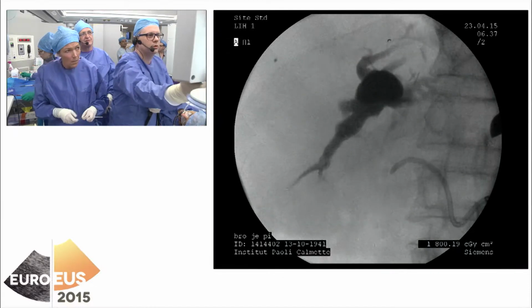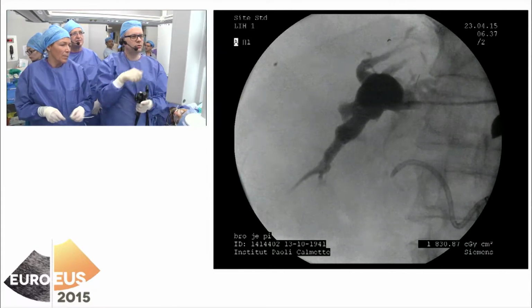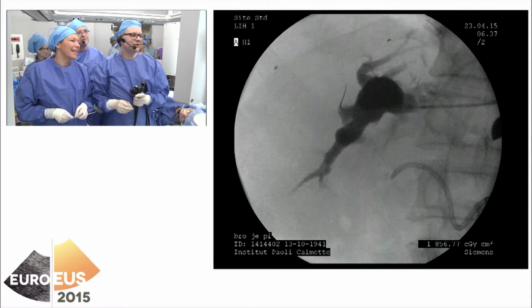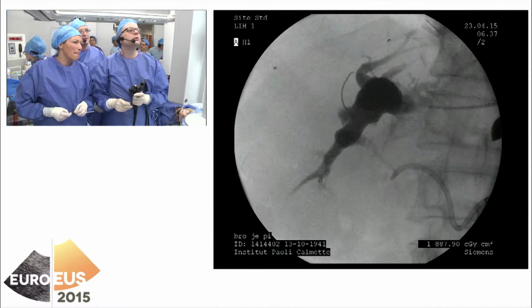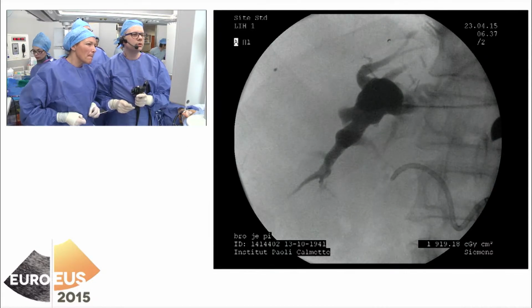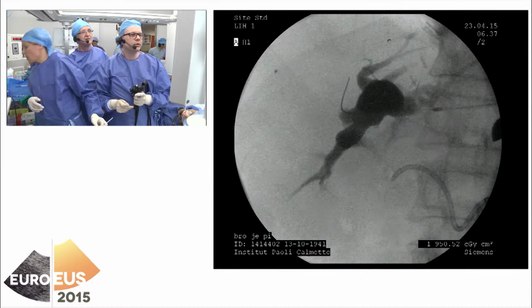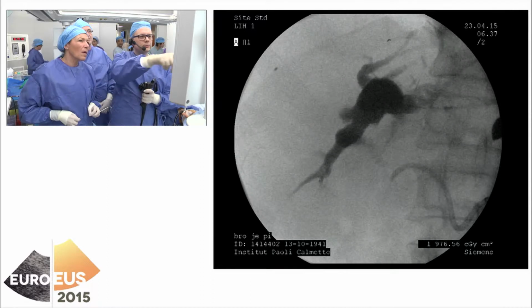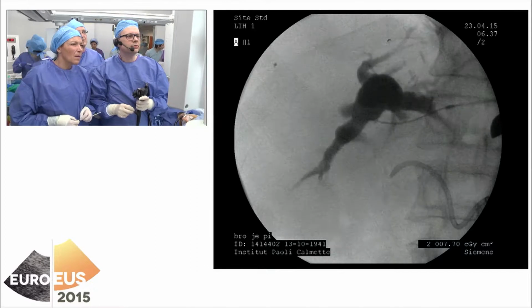Sorry. It's not a good way. So we'll change. I pull back to go. Yes, but okay, this way maybe. No, this is again a secondary way. But you are there. No. So I will try from here. I could be back, but maybe here. If you have to. Yes.